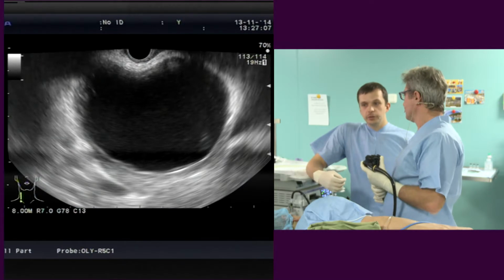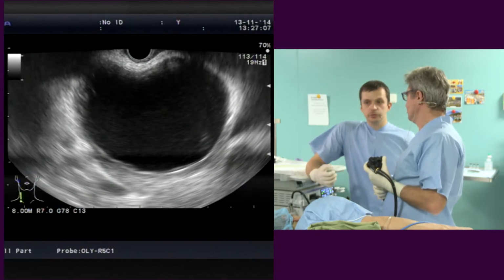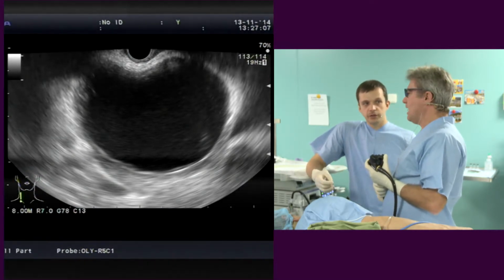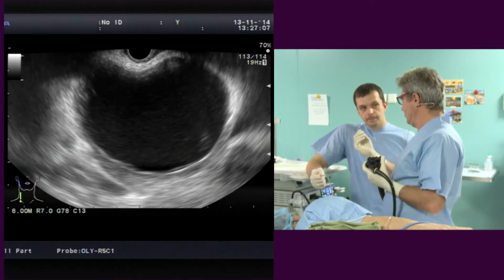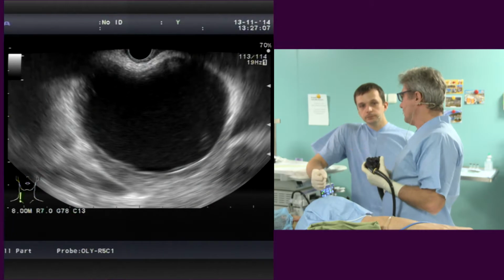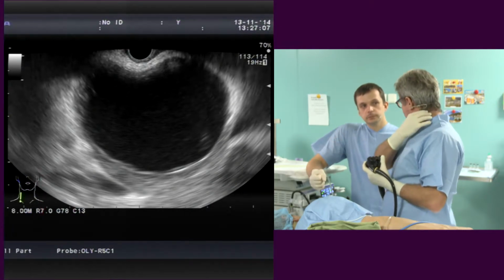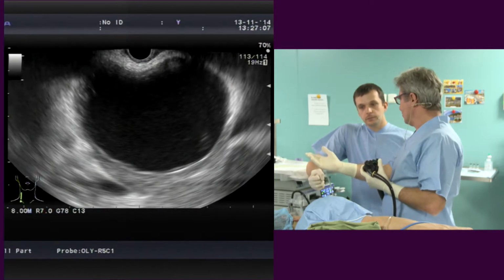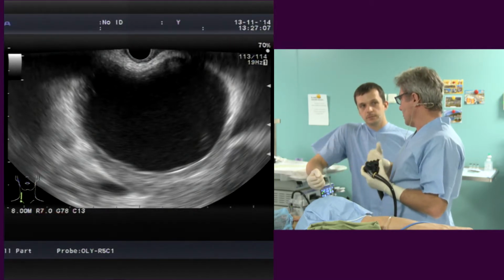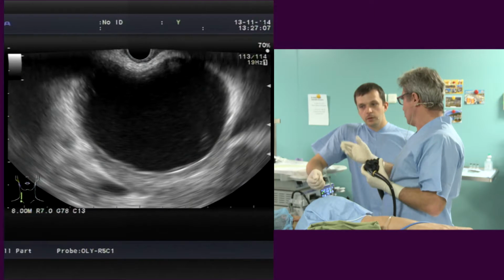That means we don't need to use such things as CEA and CA19-9. In this case, I would not do it, unless the fluid is kind of strange. I think the clinical history is clear. There was nothing 2 months ago. Now there is a collection, so this is an inflammatory collection that was caused by the previous episode of acute pancreatitis.